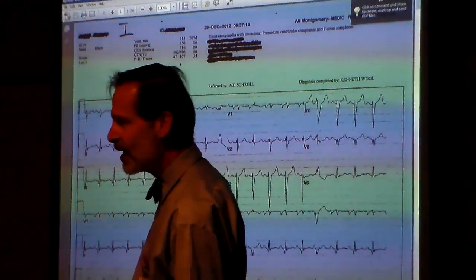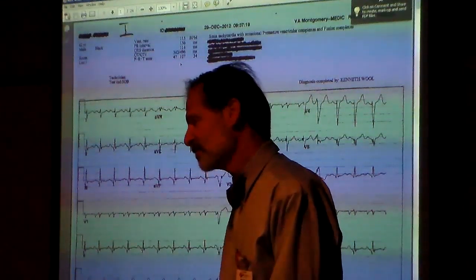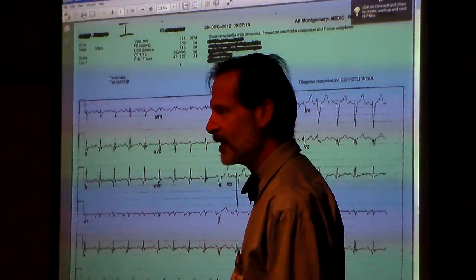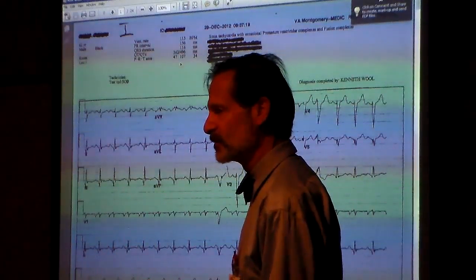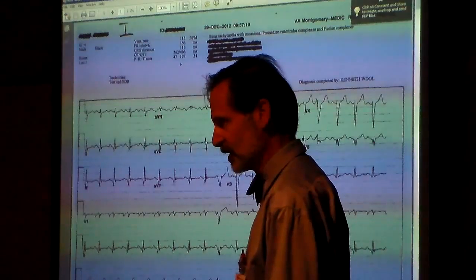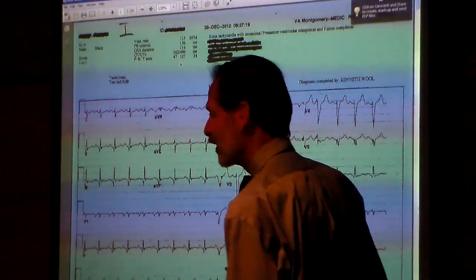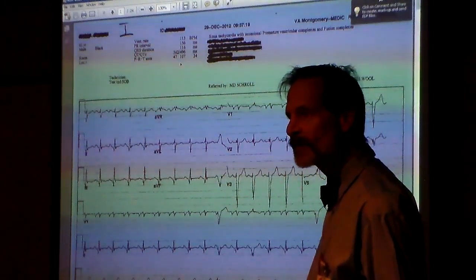So if you're tapping it out and you have a premature beat, and then the next beat falls back in time, you know it's a PVC, right? That's the compensatory pause. A PAC resets the sinus mechanism so you don't have a compensatory pause. Are you following me? Yes, I am. Okay. Are y'all all following me? What do I mean by the compensatory pause? Once again. Okay.